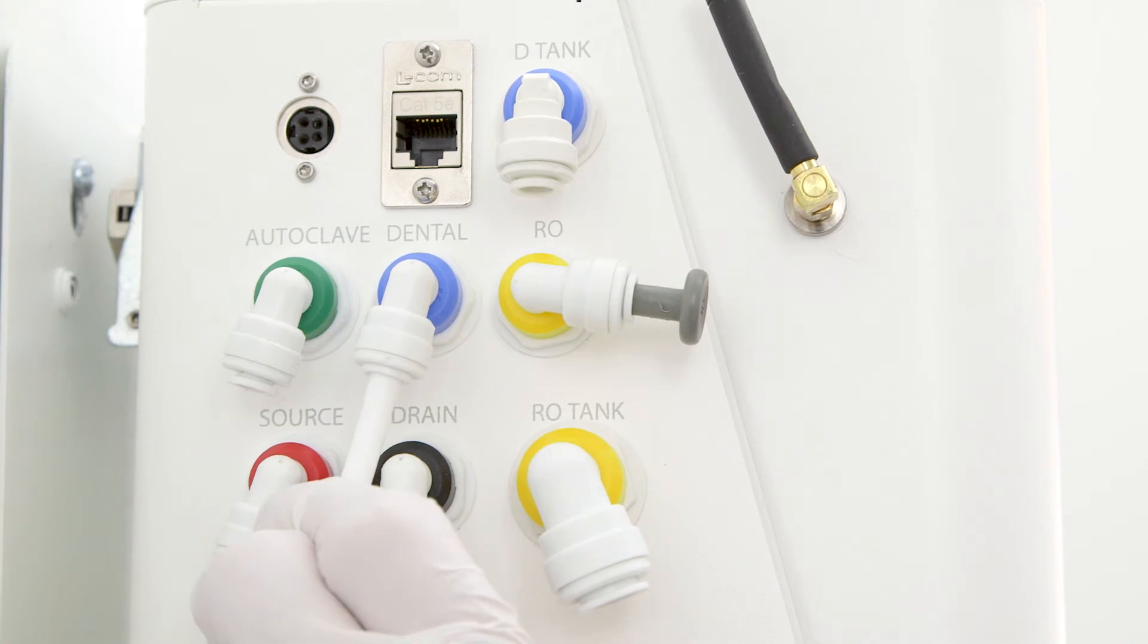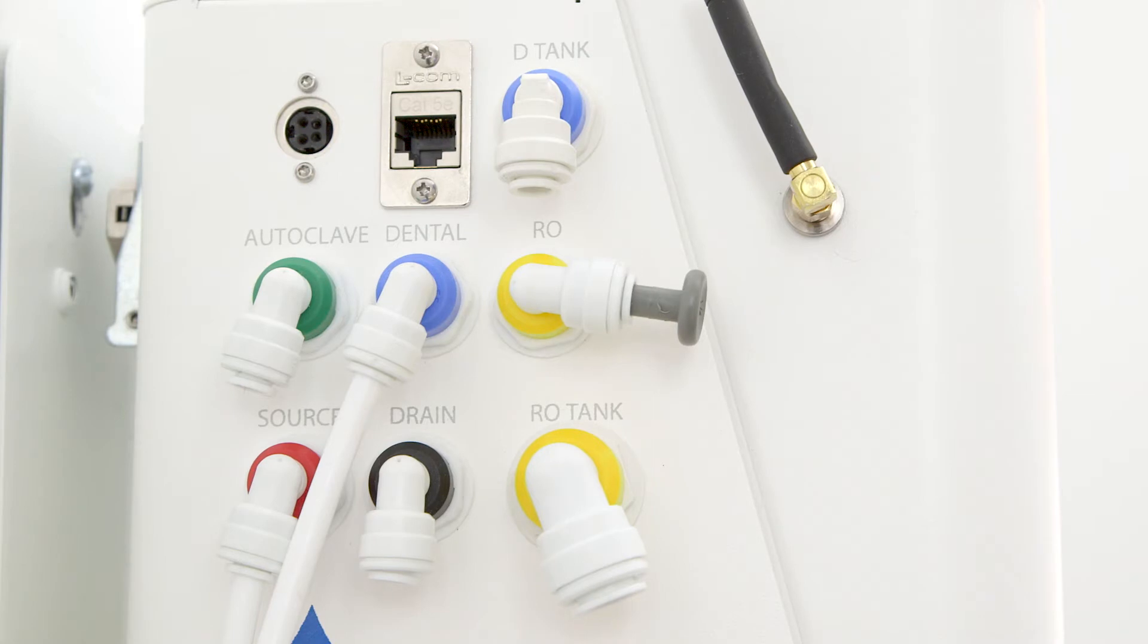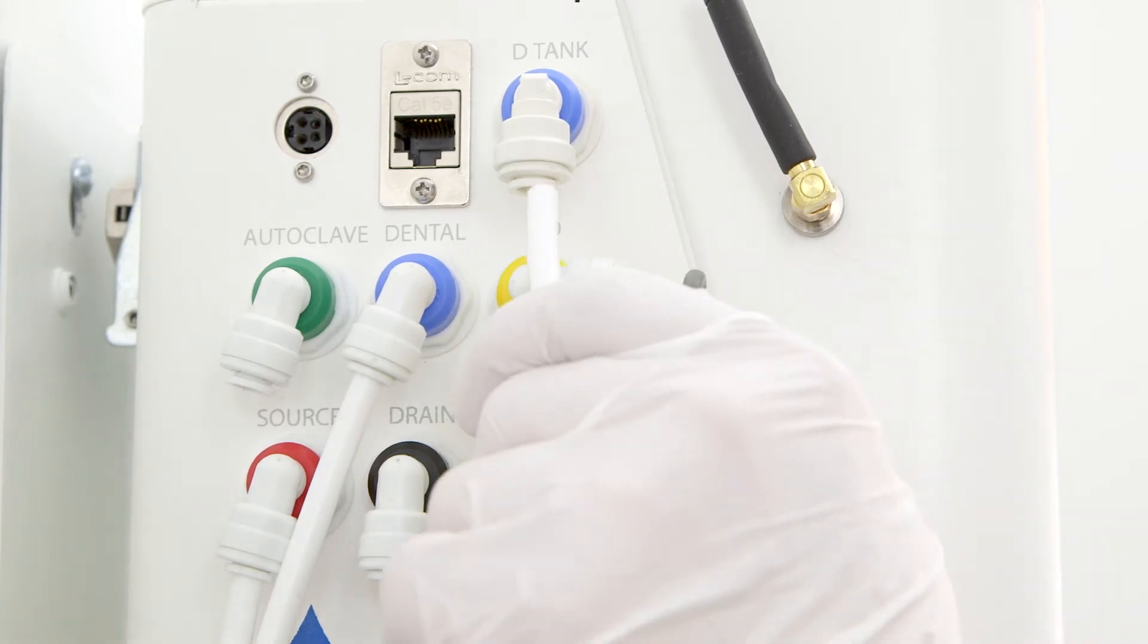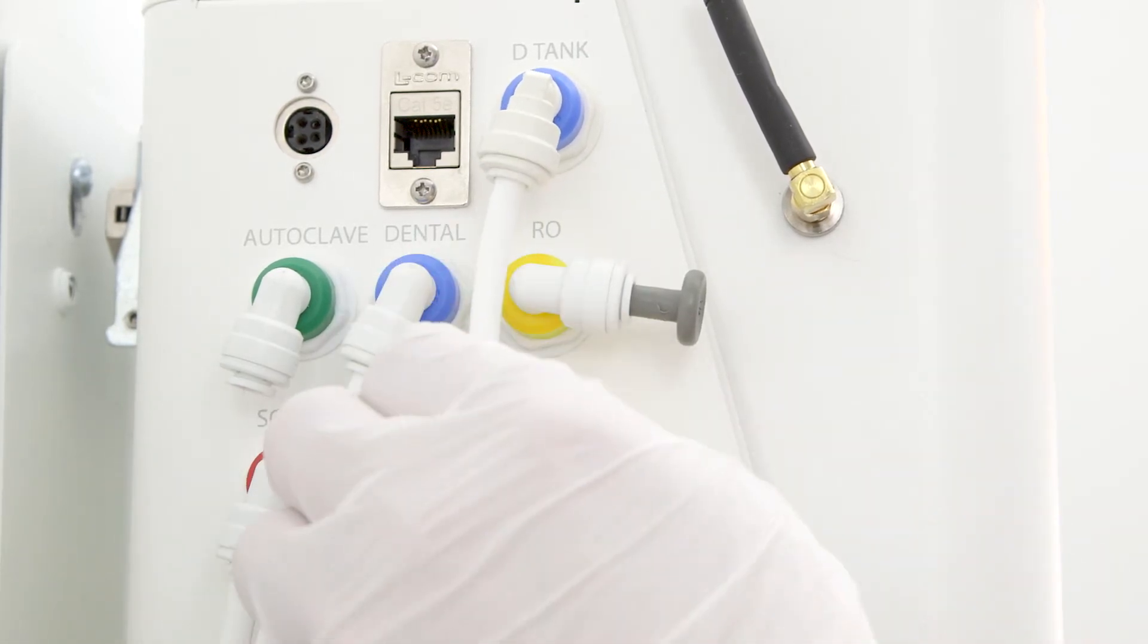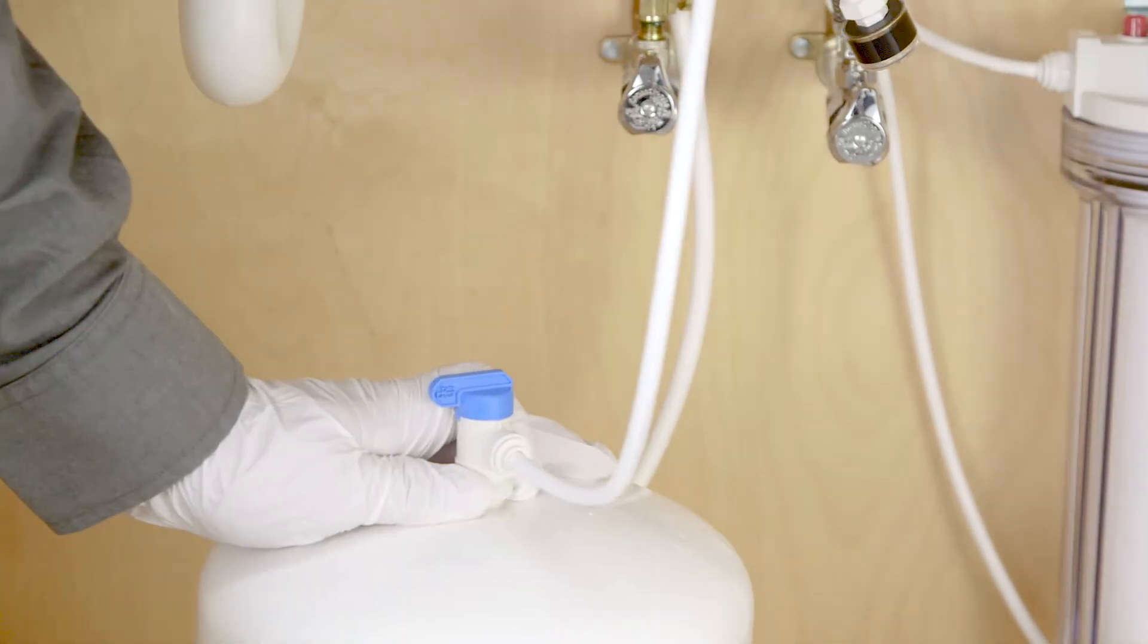Dental port. Run a quarter inch line from the blue dental port on the system to the dental water faucet. D-tank port. Now run quarter inch tubing from the blue D-tank port on the system to the quarter inch tank ball valve on the dental water storage tank.